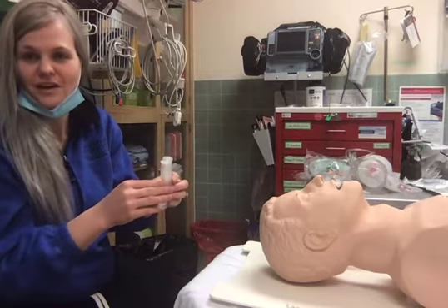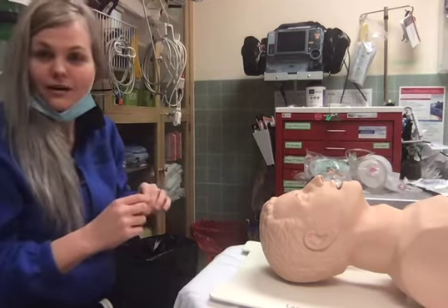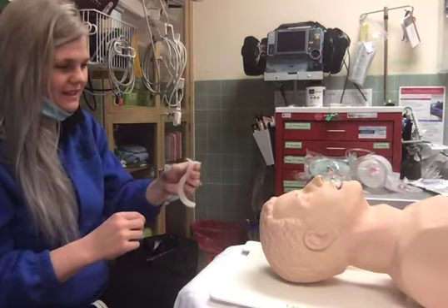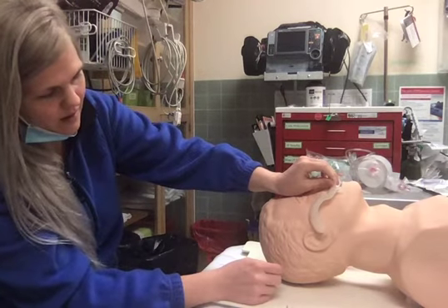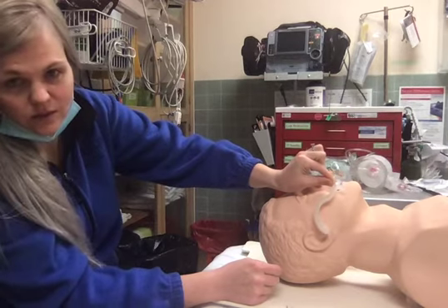Contraindication for this is if they are awake, don't try to stick this in their mouth. They will immediately tell you that that's not going to happen. Proper sizing is very important with these. You're going to be looking at the tragus and the corner of the mouth. So this is a correct size for this patient.